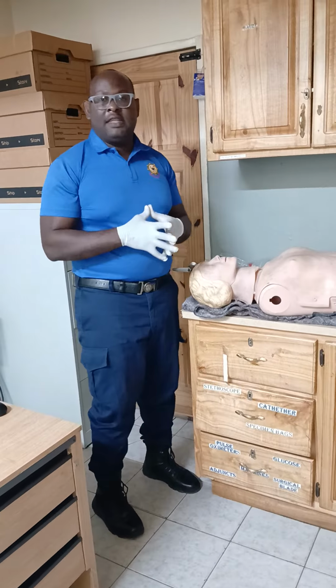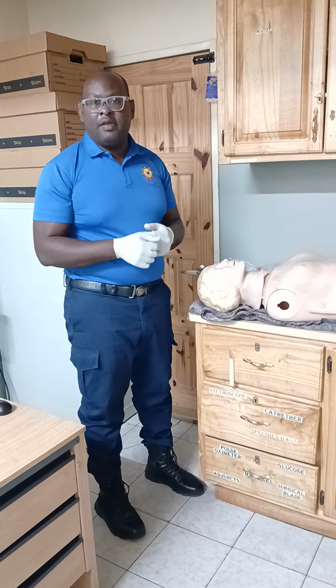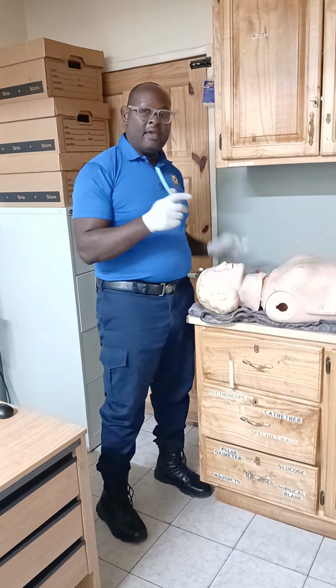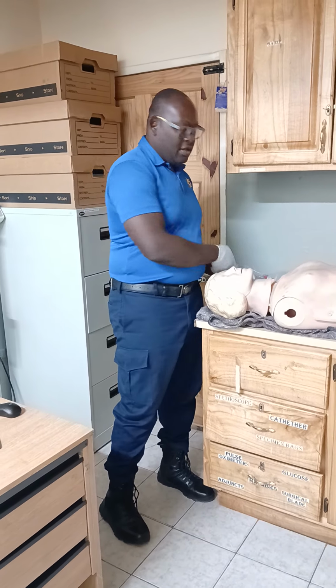Afternoon, folks. My name is EMT Studdart, and today we'll be doing a demonstration of using the OPA and the NPA for a trauma patient, right?